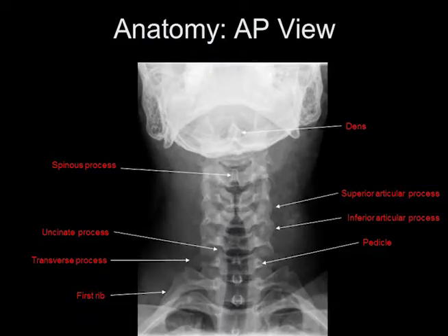On the AP view, you can see the dens projecting over the mandible. You can also see the spinous processes. You can see the uncinate processes of the vertebral bodies, which are these pointy structures. You can see the transverse processes, the superior and inferior articular processes, and the pedicles, which are round.